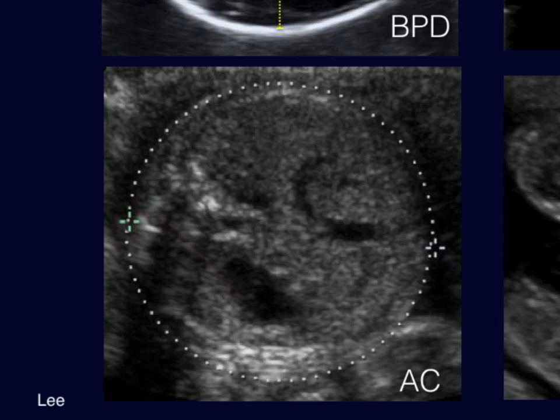The abdomen should be as circular as possible, with the fetal spine ranging between the 3 and 9 o'clock position. A fetal stomach should be seen on the left side. The intrahepatic portion of umbilical vein should be visualized with no more than one rib visible on each side. The kidney should not be seen in the image. A circumferential ellipse measurement is placed on the outside skin edge, with the surrounding skin being seen in its entirety if possible.